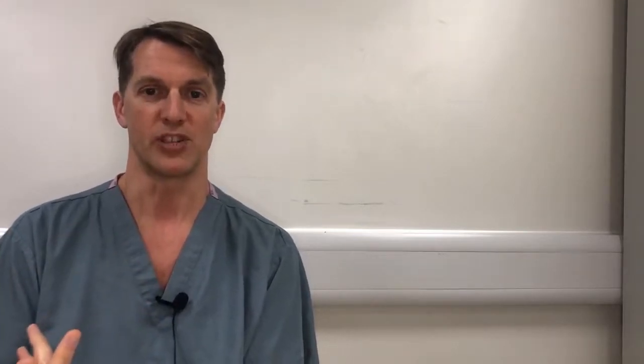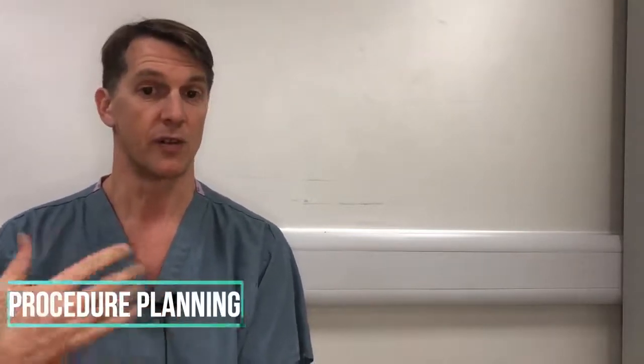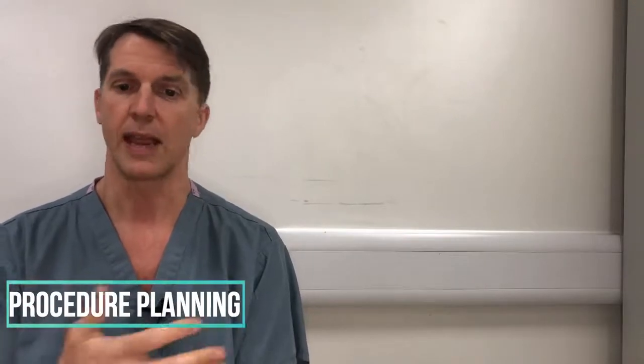Now, once the lesion's been detected and characterized and a decision has been made as to whether it can be resected curatively, you need to plan the procedure. These are undertaken under a full general anaesthetic and can take anywhere from 30 minutes to 4 hours for the larger lesions in difficult to access places. ESD is easiest in the antrum and hardest in places like the cardia and parts of the lesser curve.